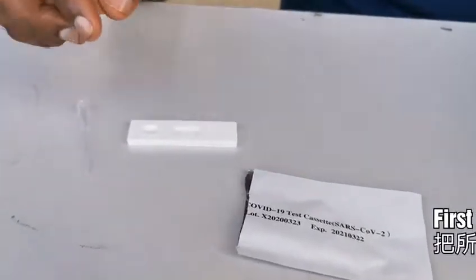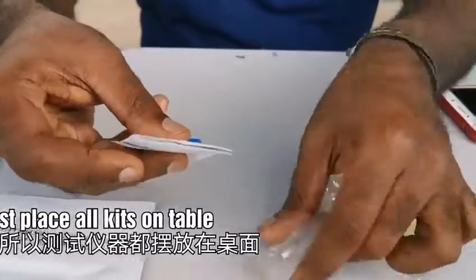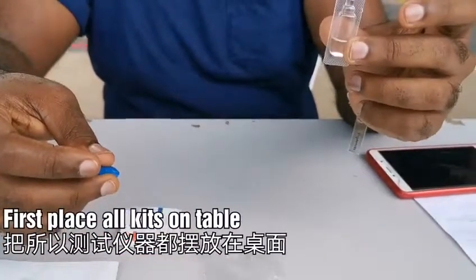This is the test kit. This is the prick and alcohol swab, and this is the solution.